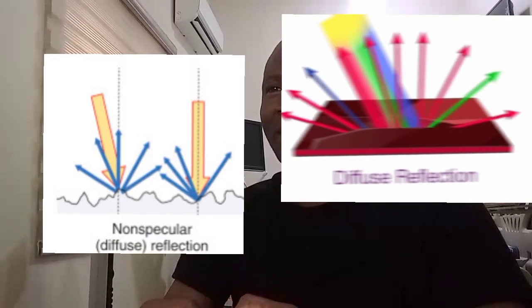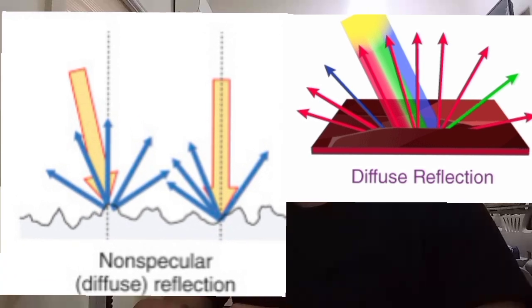What about non-specular reflection, or backscattering? This occurs when the reflecting surface is approximately equal to, or smaller in diameter than, the wavelength of the incident sound wave. The portion of the sound energy returning to the transducer is known as backscatter. It is detected as a relatively weak echo by the transducer in comparison to the echo amplitude from specular reflectors.